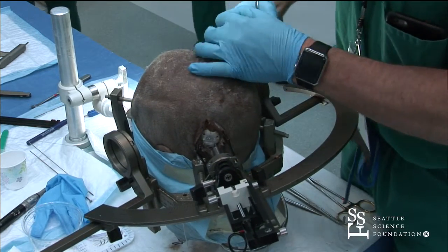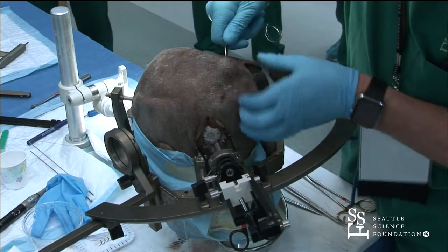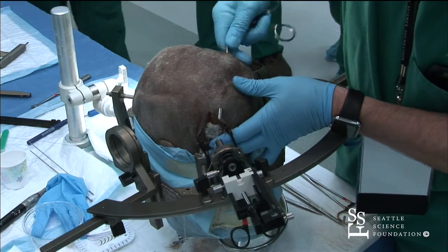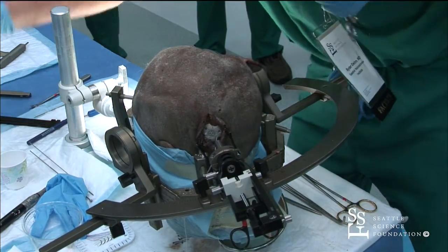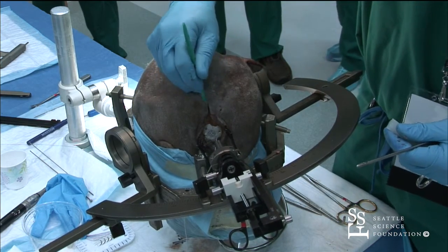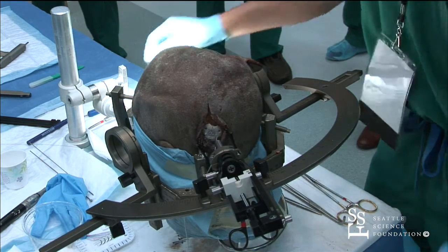We're a little bit far. Well, that's not quite right. So I'll just open this up more. You got one?